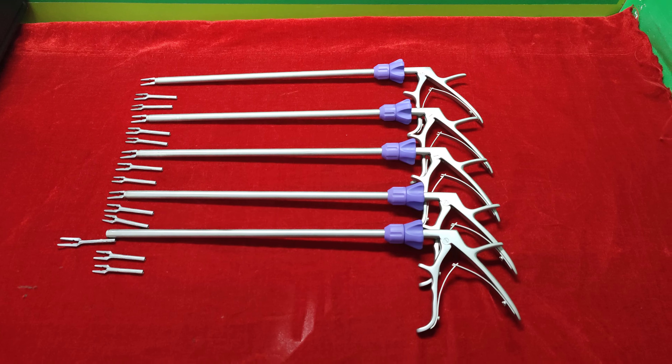Now I am going to show you how to remove this jaw. I am going to rotate this clockwise and anticlockwise. This is also rotatable.